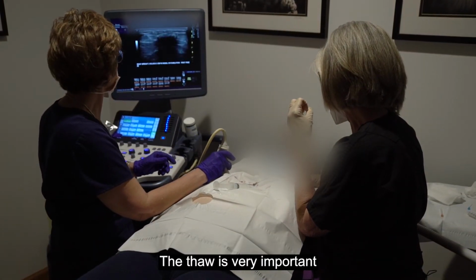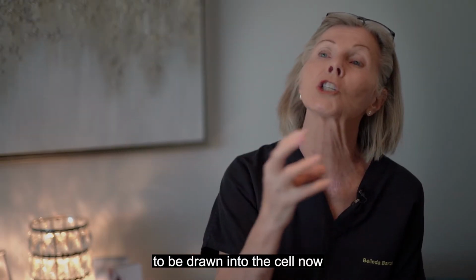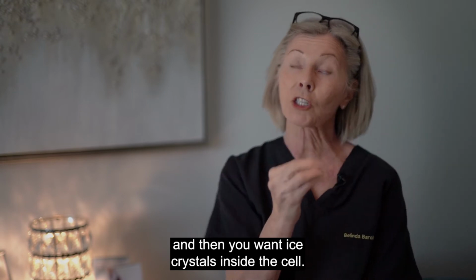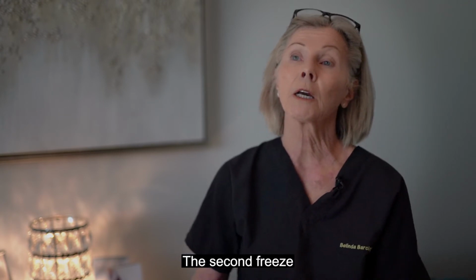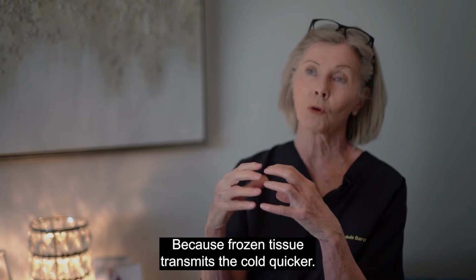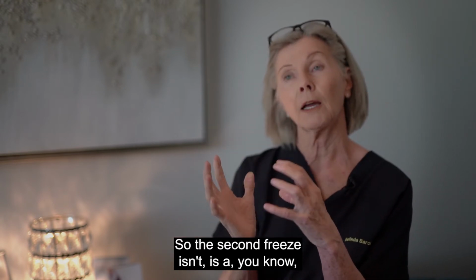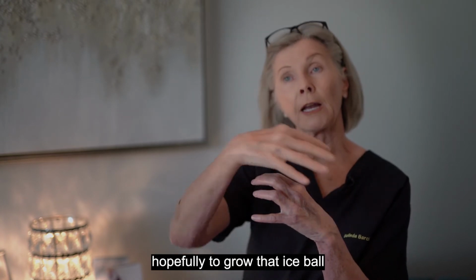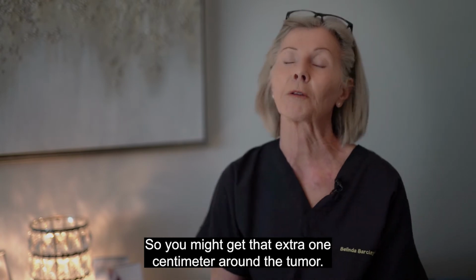The thaw is very important, because you want that cold fluid to be drawn into the cell, and then you want ice crystals inside the cell. The second freeze effectively enlarges the ice ball a little bit further, because frozen tissue transmits the cold quicker. So the second freeze is hopefully to grow that ice ball even a little bit bigger. So you might get that extra 1 centimeter around the tumor.